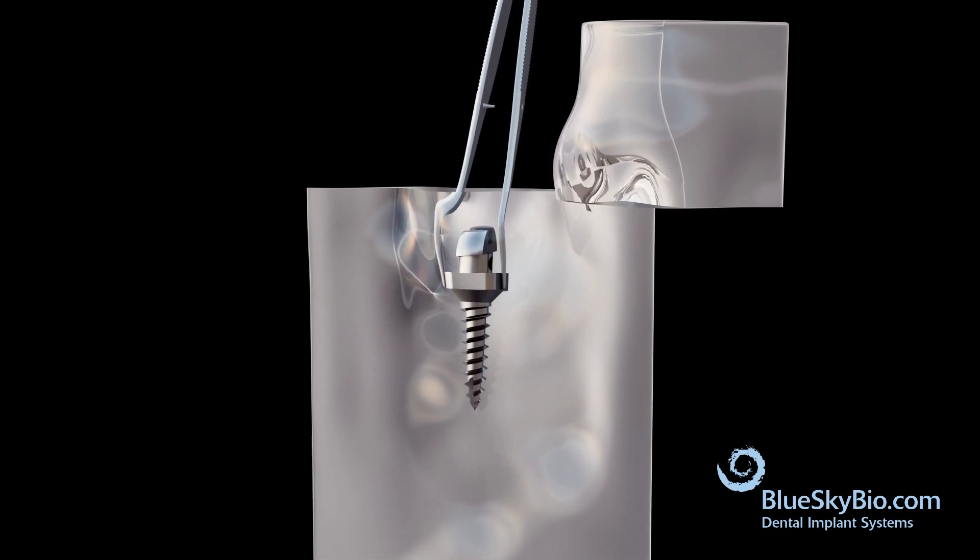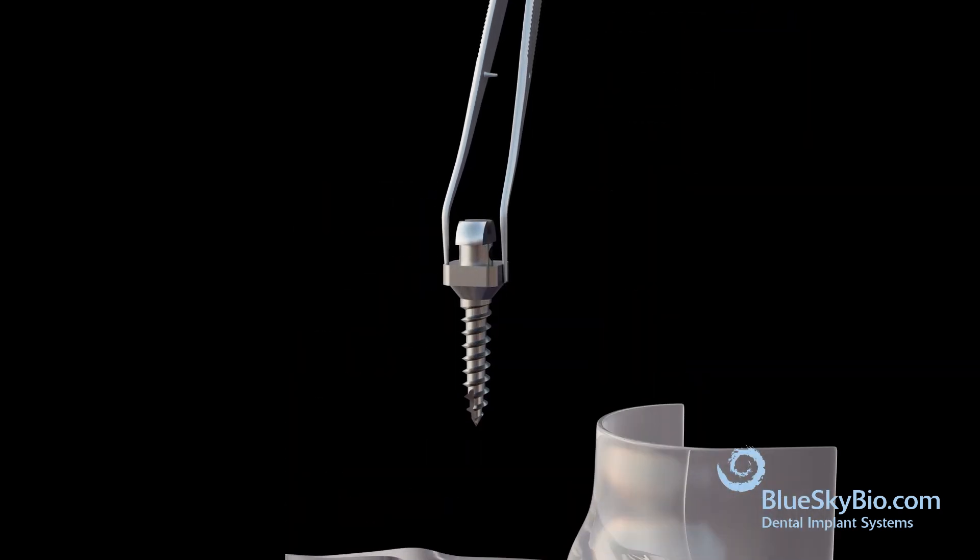With a pair of tweezers, remove the TAD. Now transfer it to the implant holder.